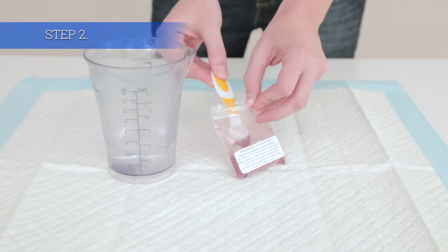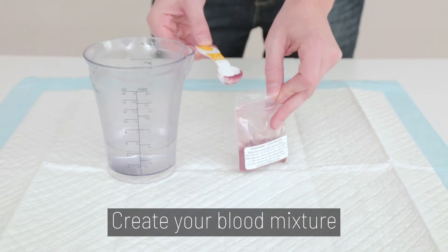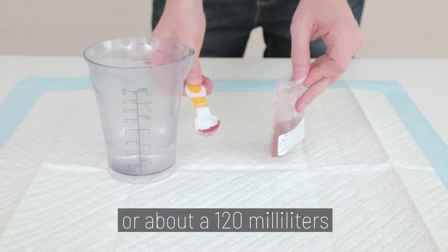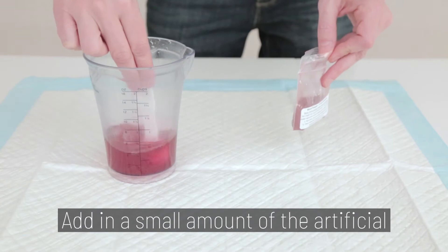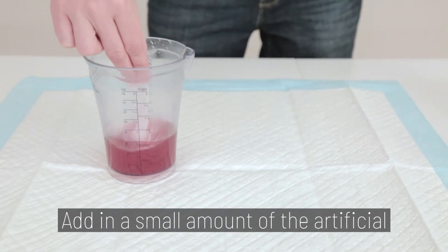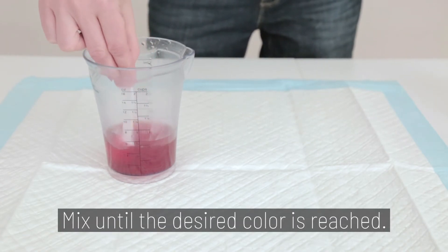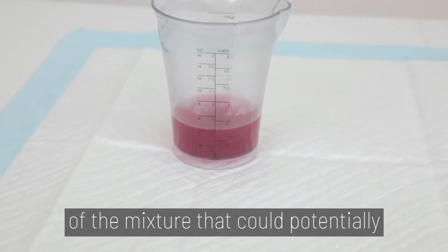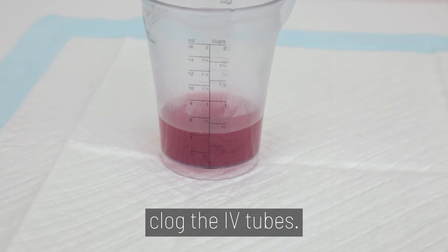Step 2. Create your blood mixture. Use a half a cup of water or about 120 milliliters. Add in a small amount of the artificial blood powder to the water. Mix until the desired color is reached and there's no sediment at the bottom of the mixture that could potentially clog the IV tube.